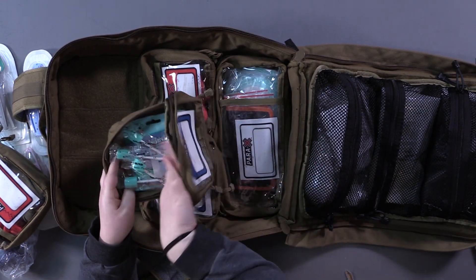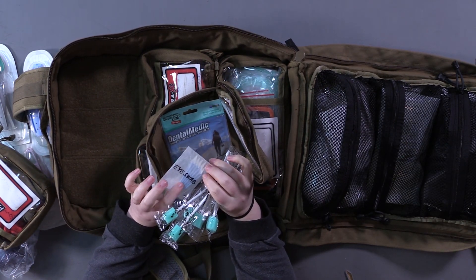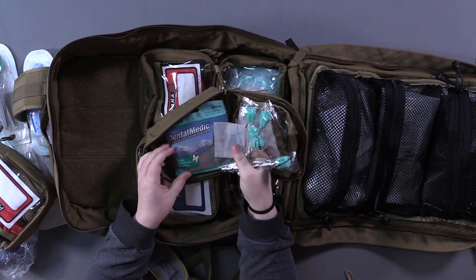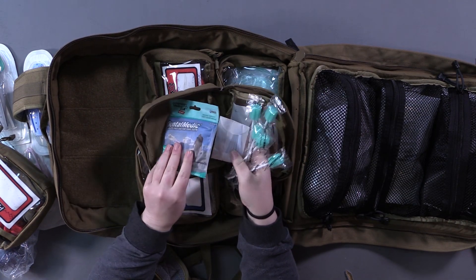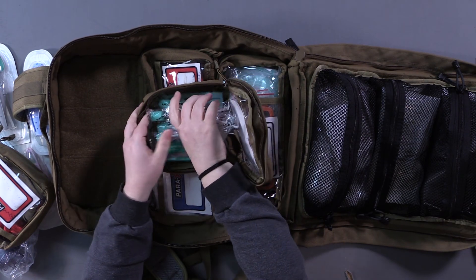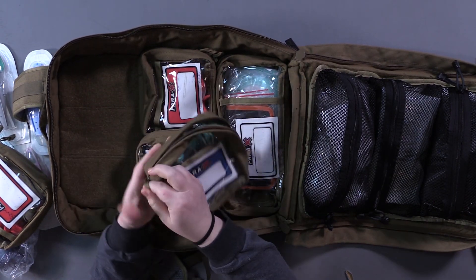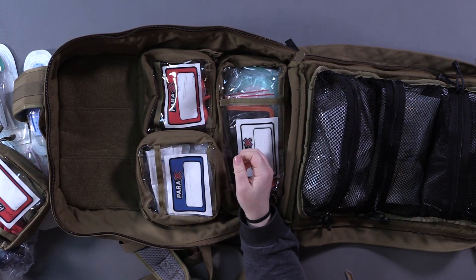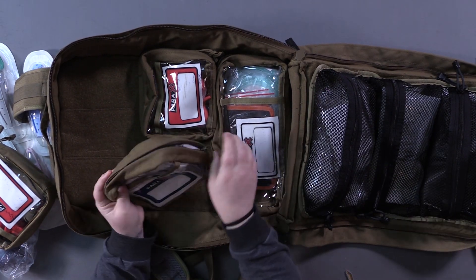This pocket has little mouth swabs, eye swabs to remove anything that gets in your eye, and a dental kit in case something is going on there. This is not just a trauma bag — it's kind of an all-inclusive 'if something happens to your kid' bag.